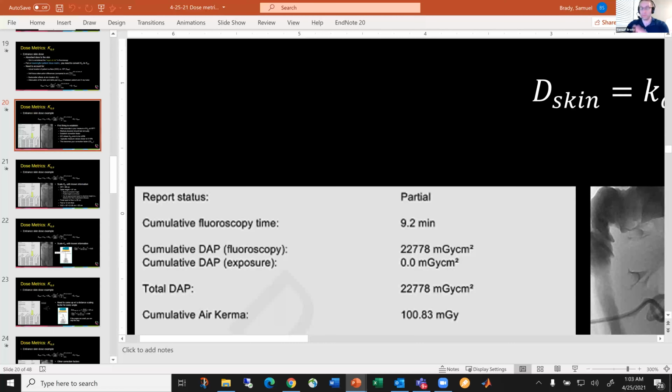So I would track it. And if you want, I would do a diagnostic reference level. I think it's important because dental is maybe the one thing, along with intraoral, that is more uniform. Dental is something everyone gets exposed to. Typically once a year or once every couple of years, they're going to go in and get at least 4 images of their face. And so they're really low dose.